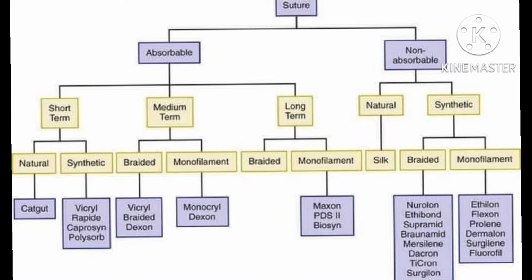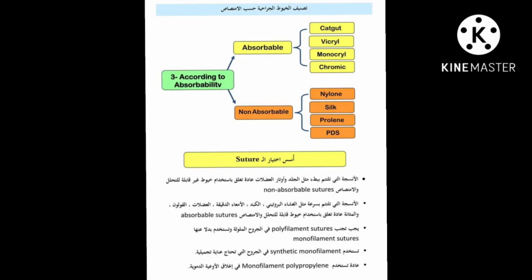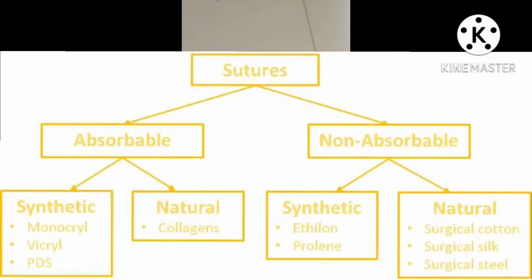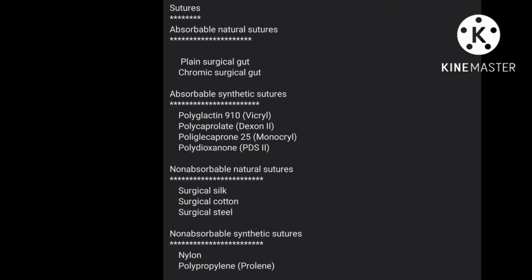The rate of absorption varies with the type of material used. Fever and a moist environment will increase the rate of absorption. Absorbable sutures are useful when suture removal may be difficult, for instance, in children or an unreliable patient.